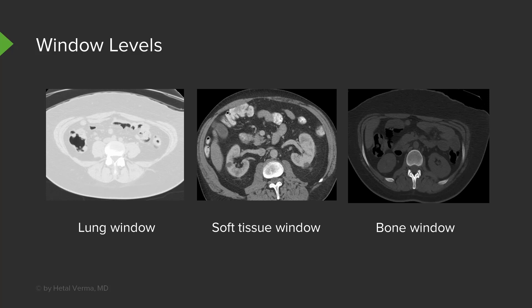Here is an example of three different types of window levels. On the left, we have lung windows, which create a very white appearance — best for viewing the lungs and also very useful for evaluating free air. In the middle is the soft tissue window, used most commonly to look at the solid organs of the abdomen. On the right is the bony window, used to examine bony structures. When reviewing a CT scan, I scroll through using each of these windows because each one shows something different.